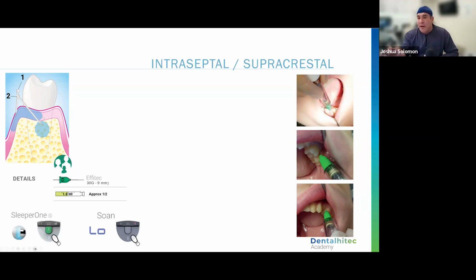If I'm really worried that the patient's going to feel anything, you can give a half. If I'm into the pulp, I'm going to give a half a carp. So anywhere between that quarter and a half. I've never given more than half a carp in a quadrant. Nope, I haven't on a child. To be honest, I haven't needed it.